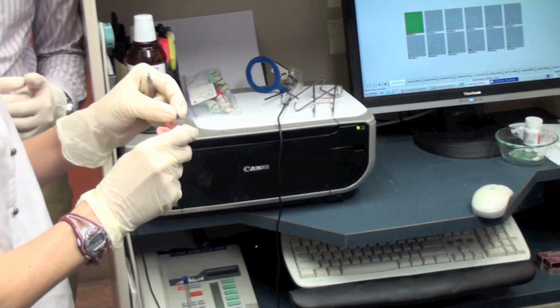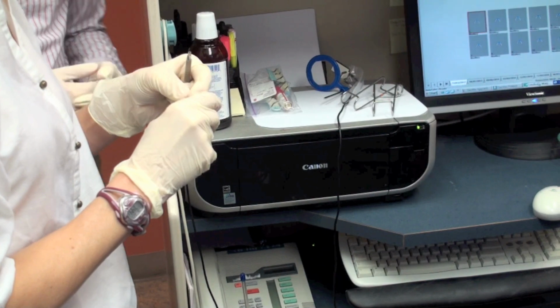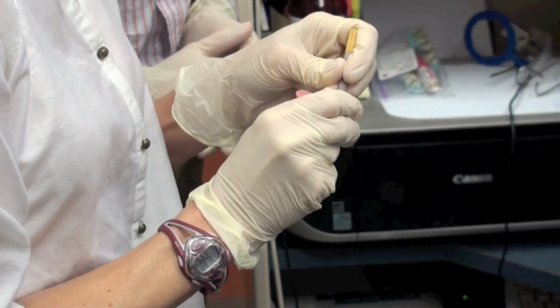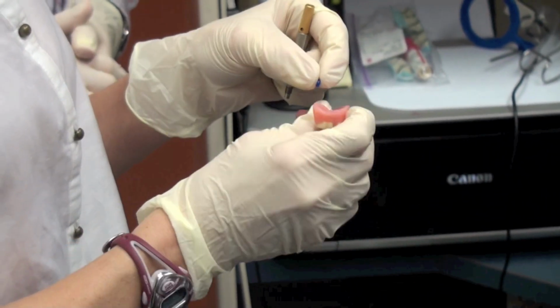Which ones do you want them in? It doesn't matter. So they're just finicky little things because they stick to you, right? Yeah. But once you get it, then you can actually snap it down. Oh, you really hear the snap. Yeah, it's nice. Very satisfying.